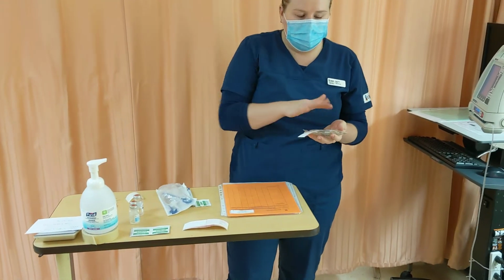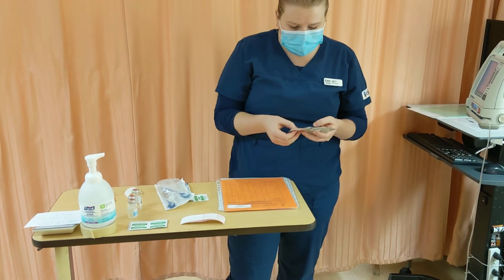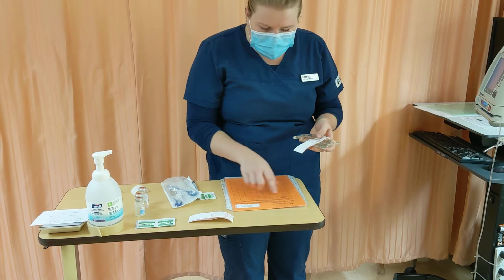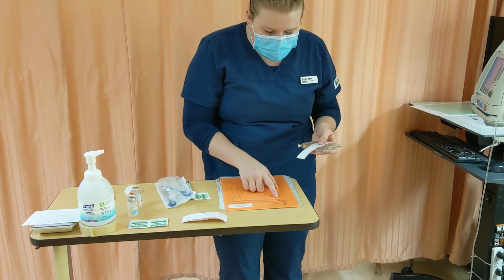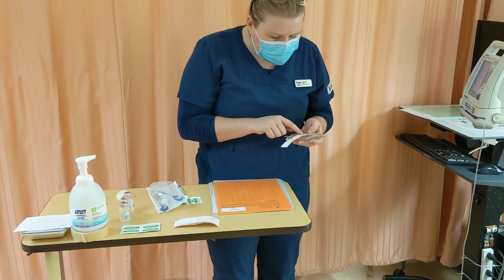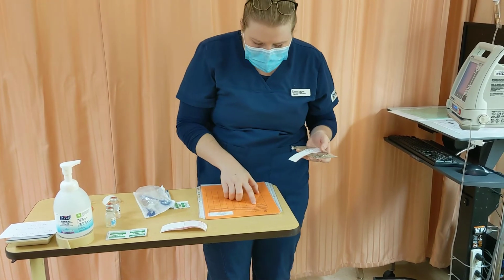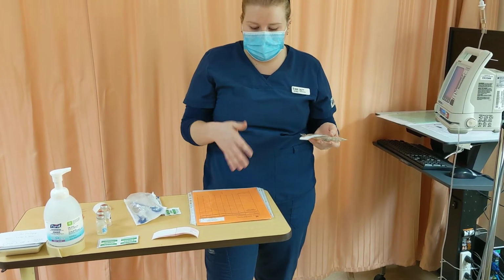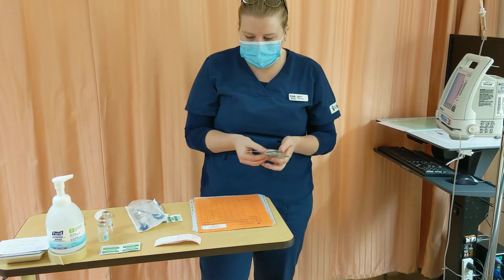I'm going to compare my medication, my label, and then my MAR. So we have Fiona Friedman, right patient, May 3rd, 1971, she's allergic to morphine. Vancomycin, right drug, 500 milligrams, right dose, IV. This is an IV piggyback, so that's the right route. Q12H, it's written here twice, it hasn't been given yet at this time, so the time is now, I can go ahead and give this medication.